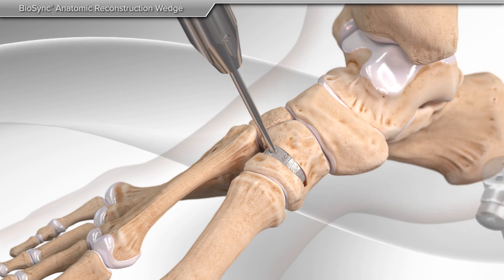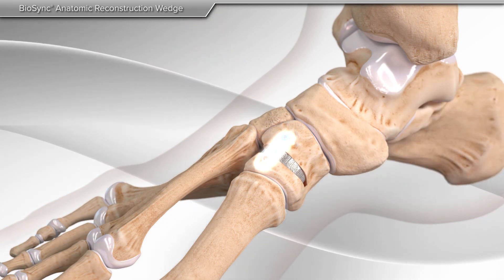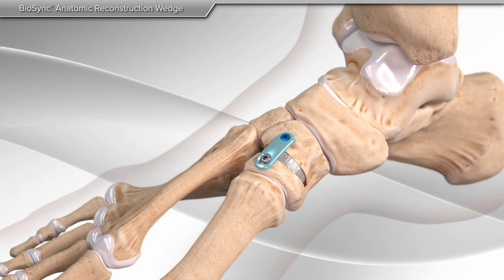Then the distractor, pins, and threaded handle are removed, completing the repair. If desired, your surgeon may choose to add an additional plate for support.